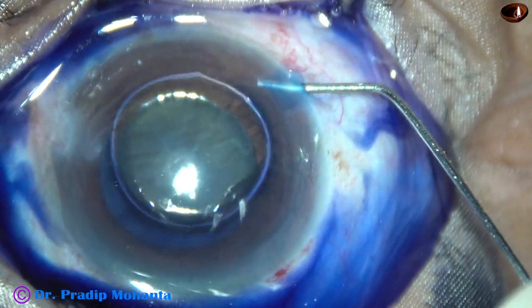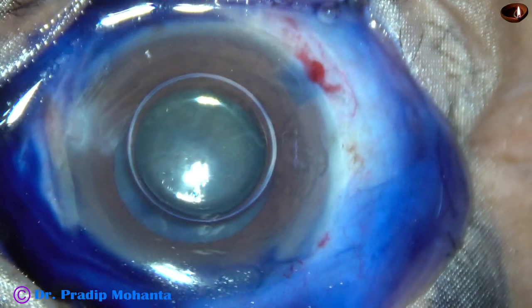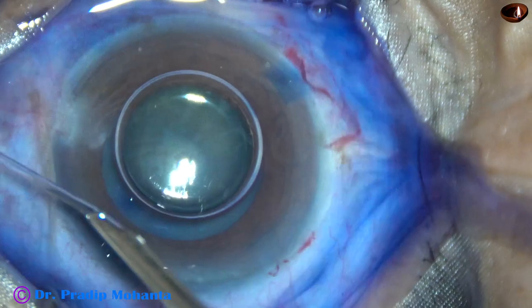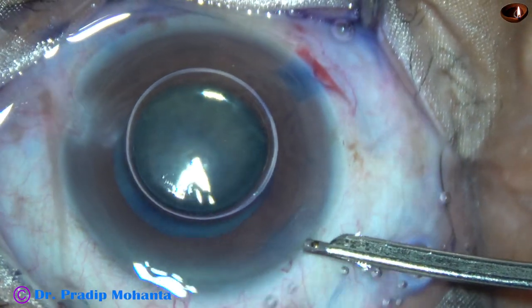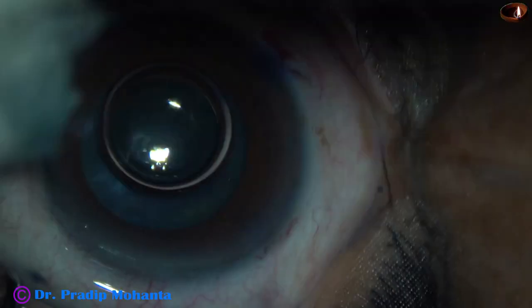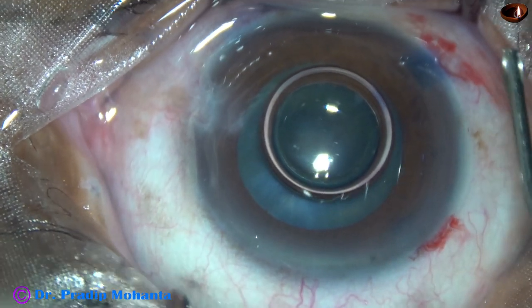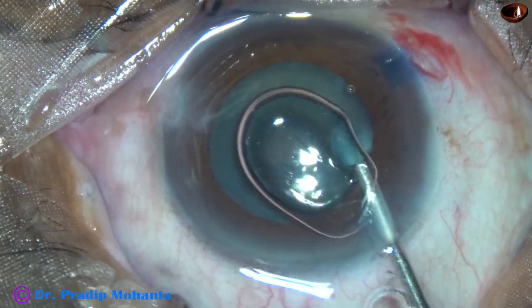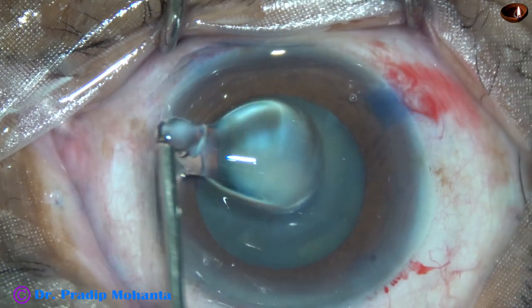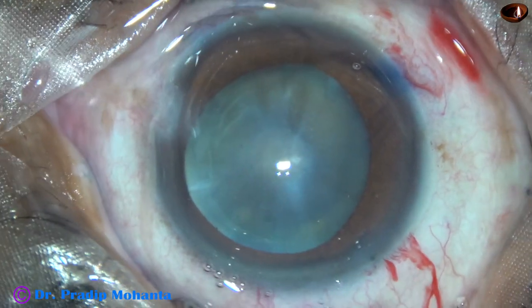This is a bit of adrenaline to see if the pupil dilates a little more. The dye is washed out. Now is the time to fill up the anterior chamber with viscoelastic substance. The visco I am using is 2% hydroxypropylmethylcellulose. The methylcellulose is applied over the cornea also for better visibility.